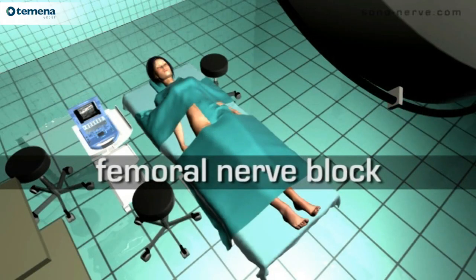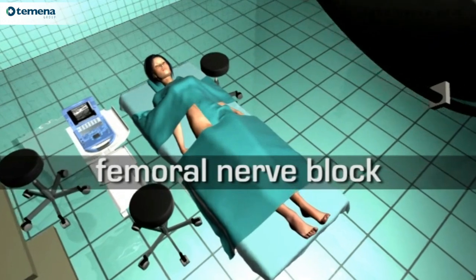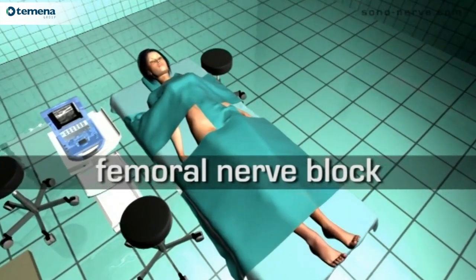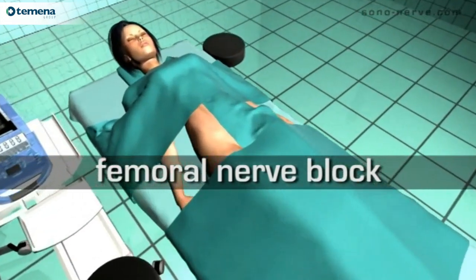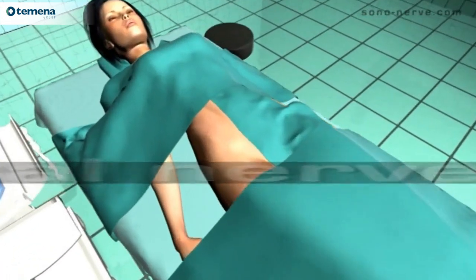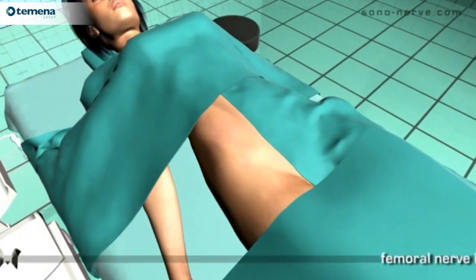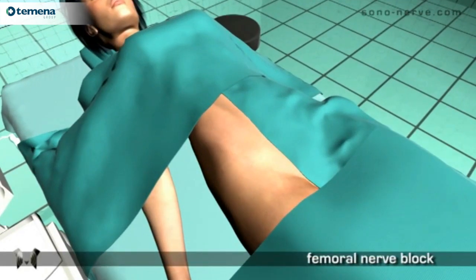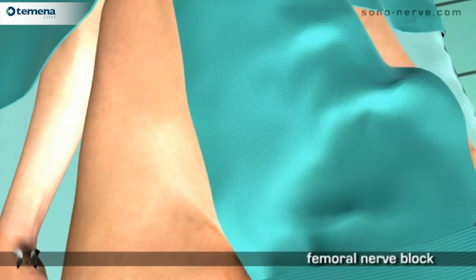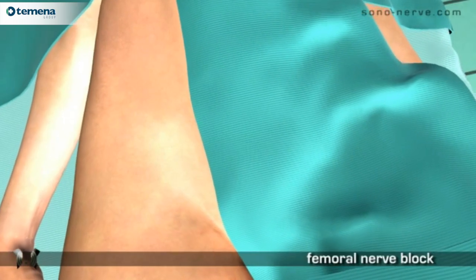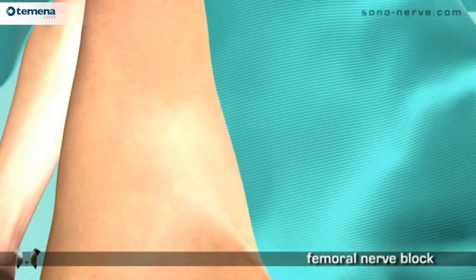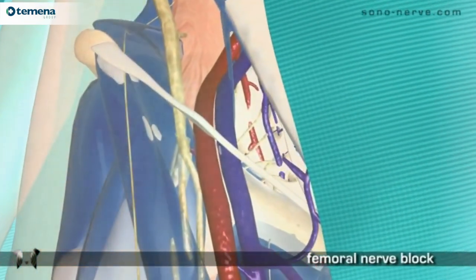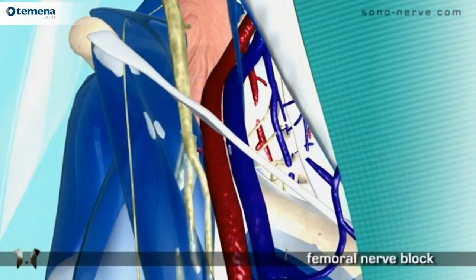Femoral Nerve Block. With the patient in the supine position and the leg slightly externally rotated, the insertion point is just distal to the inguinal ligament.